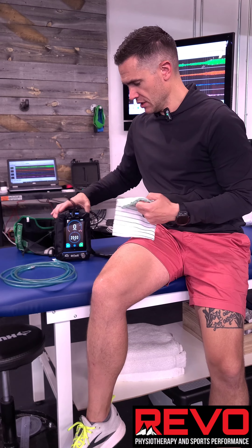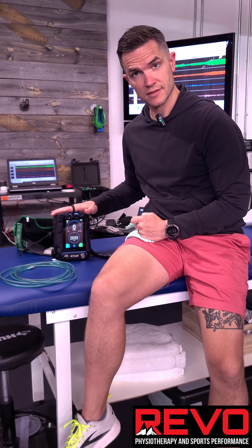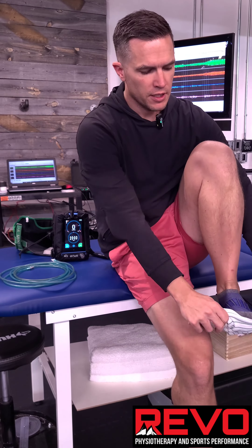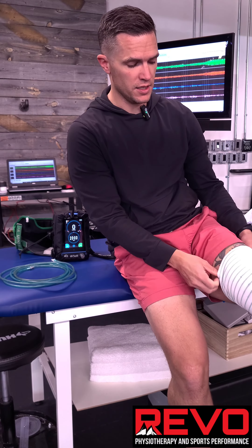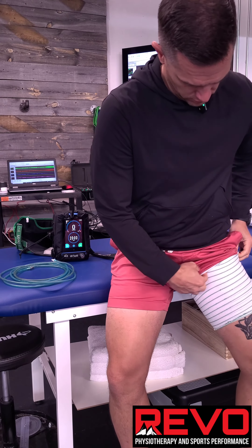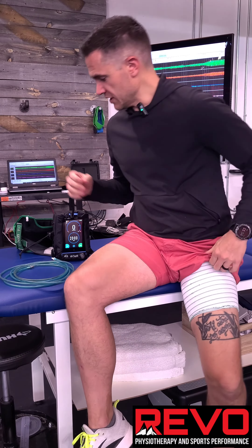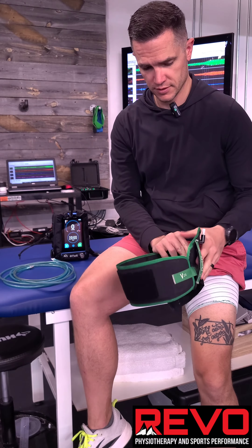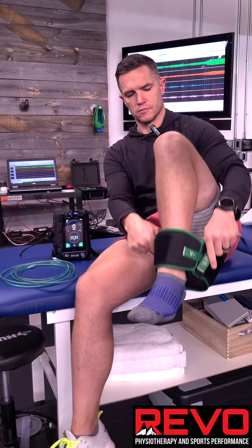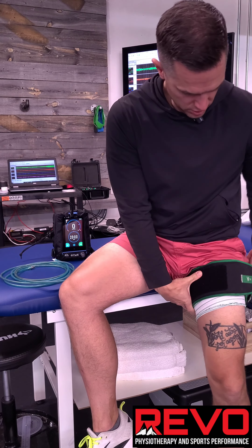First thing you're gonna do, put the machine in the jacket. Second thing you're gonna do, you're gonna take the sleeve and put it really high on the limb that you're working. You take the cuff and you put it around the sleeve, again really high so we're not harming any blood flow down low.